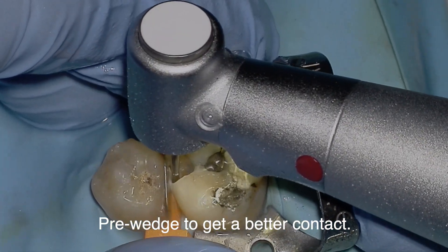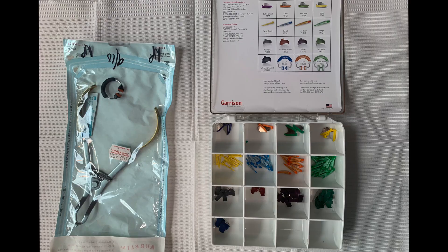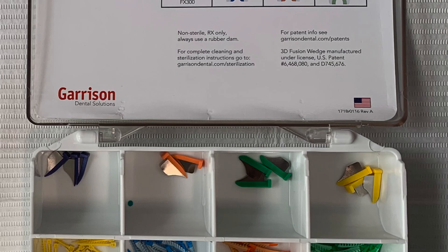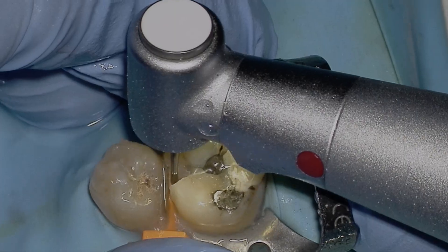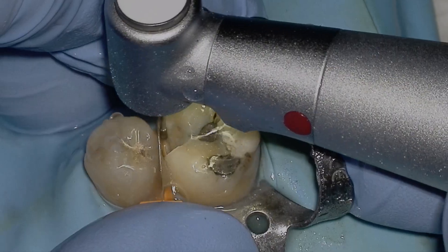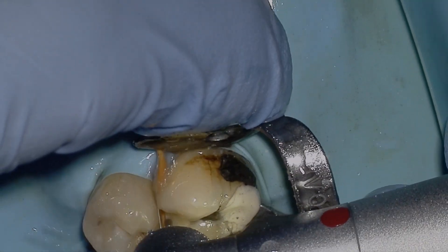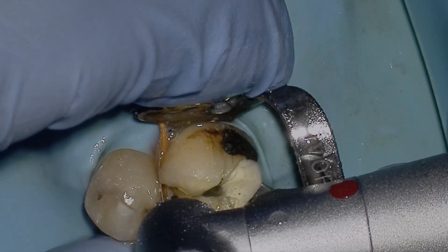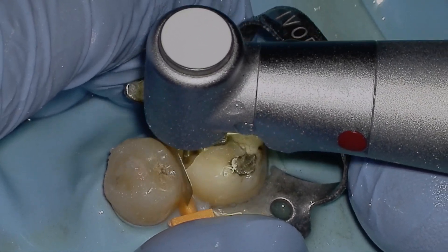Tip number three: pre-wedge to get a better contact. Even better, find these little Garrison defender shields — they have a little protector with a wedge built in. This wedge-with-defender system lets you go faster during preparation because it decreases the probability of causing damage to the adjacent tooth. Also, since composites shrink when polymerized, increasing your pre-wedging time may help you get a better contact.